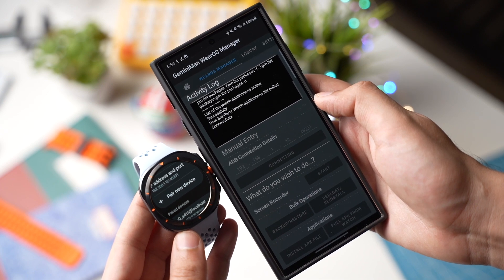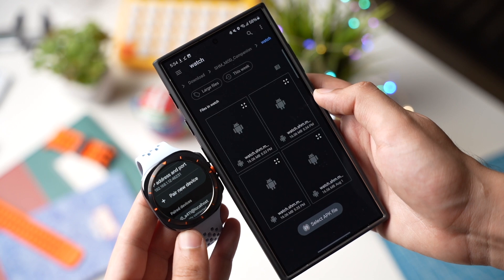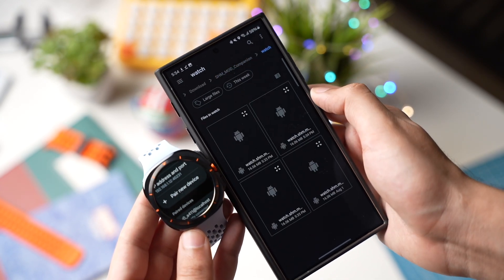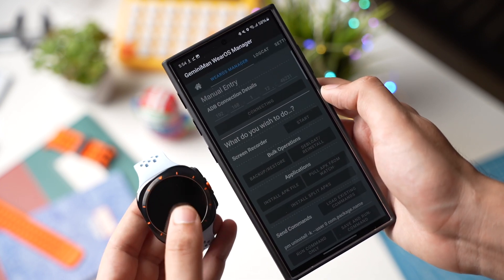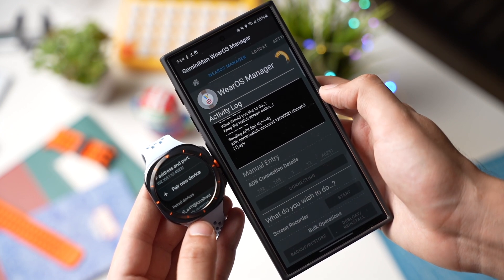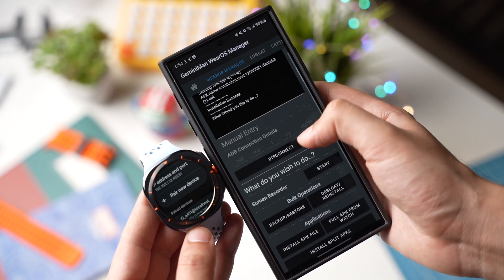Choose the downloaded SHMOD APK file that you have downloaded for your Galaxy Watch. Make sure to choose the right file — it will be in the Watch folder and will be around 16 megabytes in size. Once you have installed this app, you can uninstall Gemini Man and the companion app from your phone, as they are no longer needed.